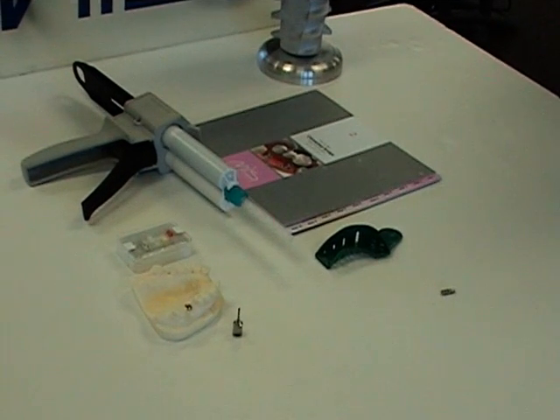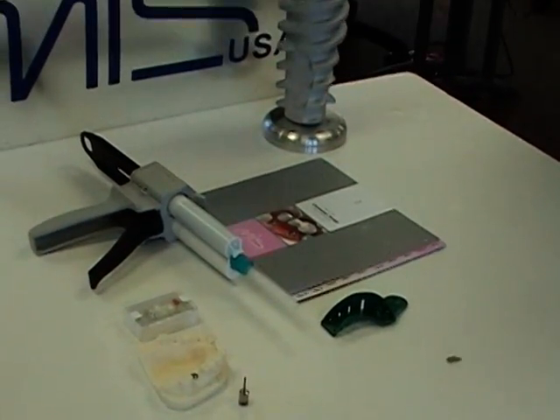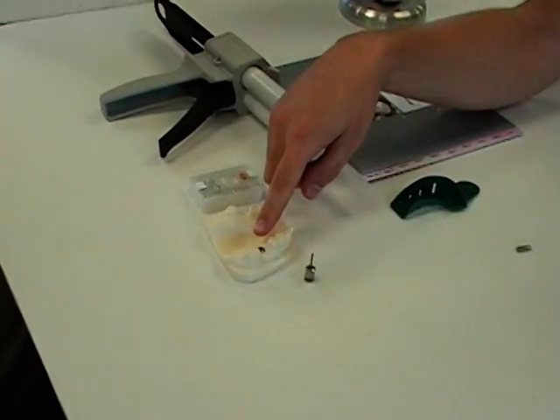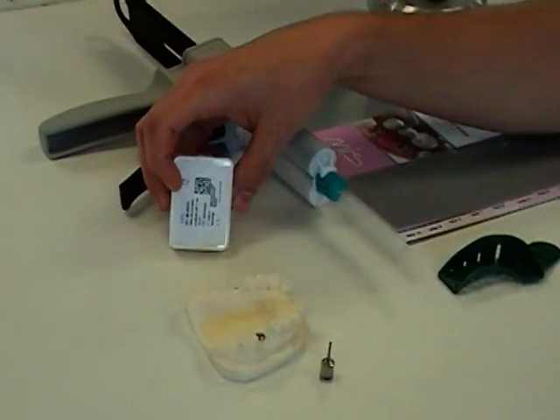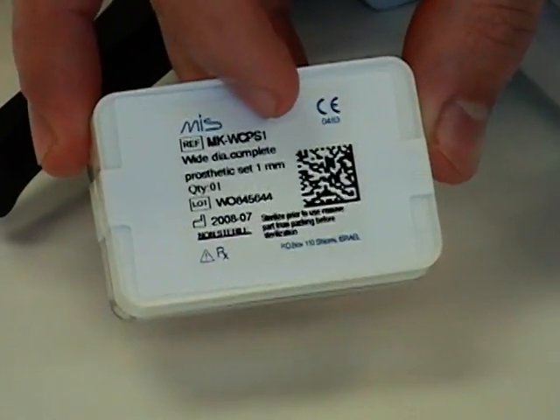What we're going to show today is how to restore an implant using the MIS Complete Prosthetic Set, or CPS. Since it's a six millimeter diameter implant, we're going to be using the wide platform Complete Prosthetic Set. We've chosen the one that's one millimeter collar height.